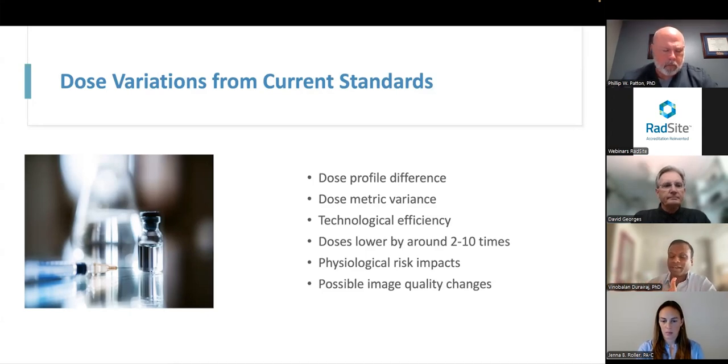and then technological efficiency. Talking about technological efficiency, let's get our experts to tell us what technological advancements we have. Not going into so much detail, but I wanted to let the experts start with David. Can you just help us understand? We all know that CurveBeam CT units are very efficient in having the scanners go faster. That's pretty much what I know from a physicist standpoint.